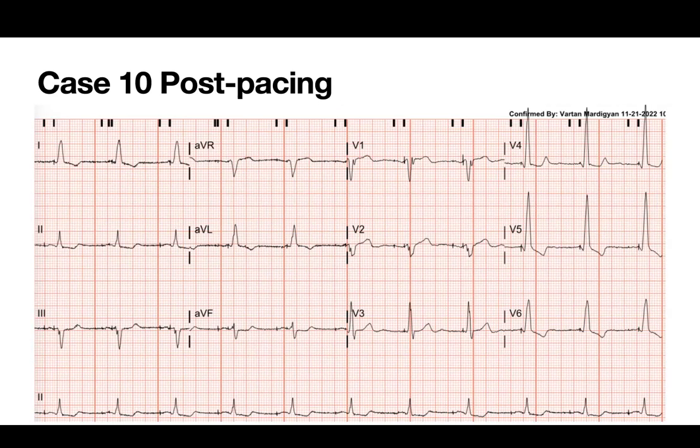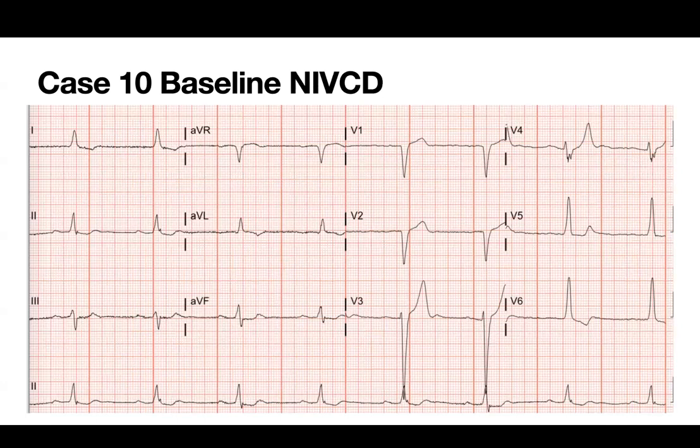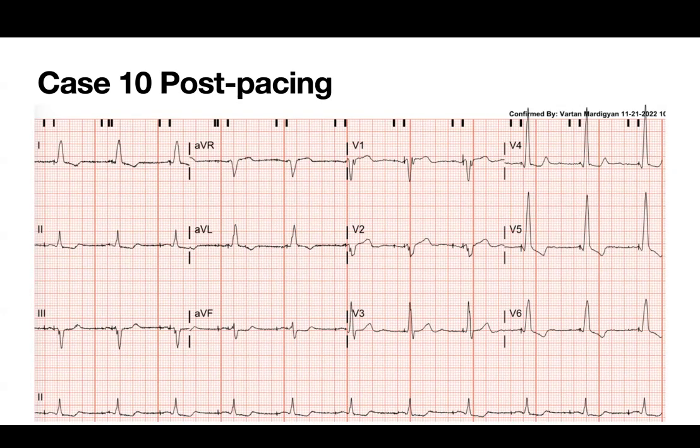Not necessarily a hard case, but how good of a narrow QRS you're going to expect. Because if you think this case was going to get a narrow QRS, it was never going to happen. I knew going in that I wasn't going to get a narrow QRS, but I was still being stubborn and trying to get a narrower LVAT. And all you're doing is shish kebab, going in and out of the left ventricle 2-3 times. It was a bad move. Knowing it now, this is one of my earlier cases. I think I would have stopped if I had an ECG like this.